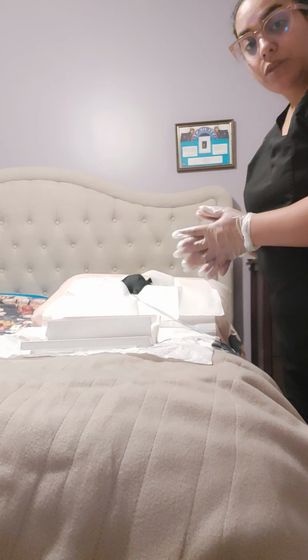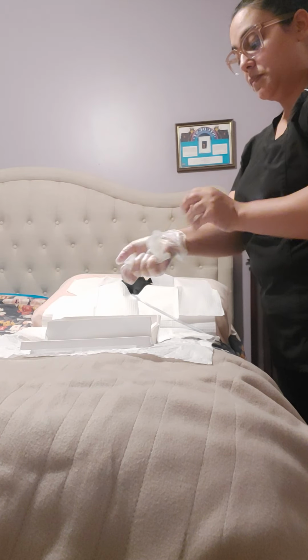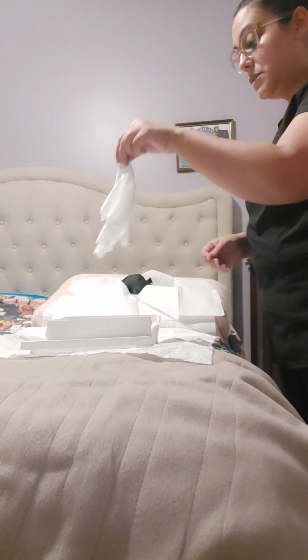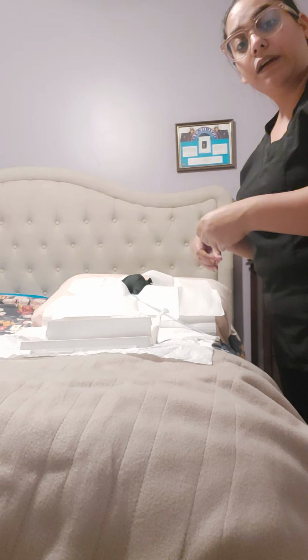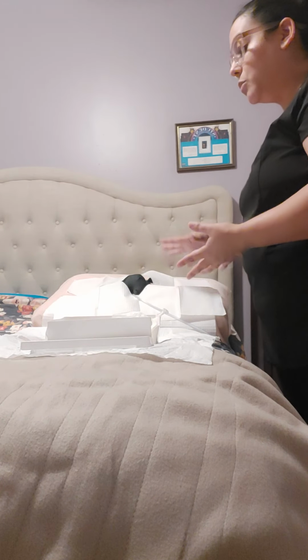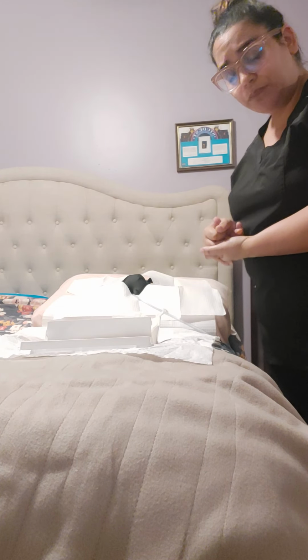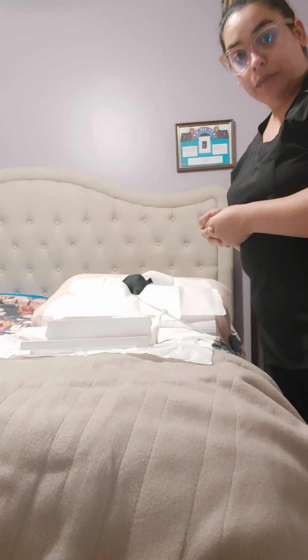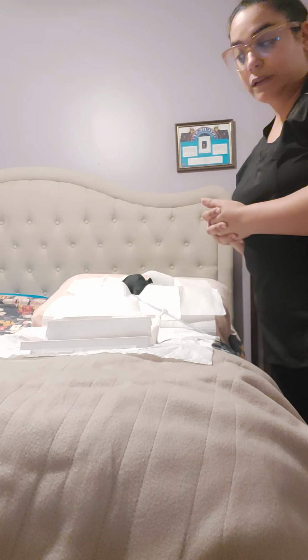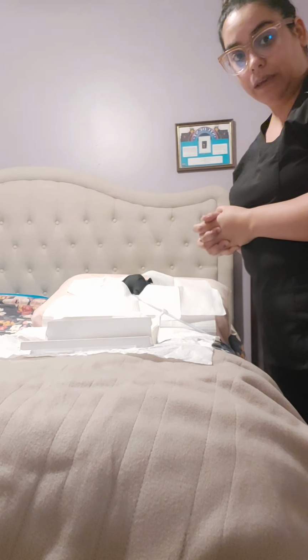Then once I am all done with the procedure, I would remove my gloves like so. All of this is no longer sterile. I would clean up my area, picking everything up, putting it away, throwing it away, and then I would drape my patient up again, put them into a position that they feel comfortable, give them the call light and make sure it's accessible to them, and exit the room if they don't need anything else from me.